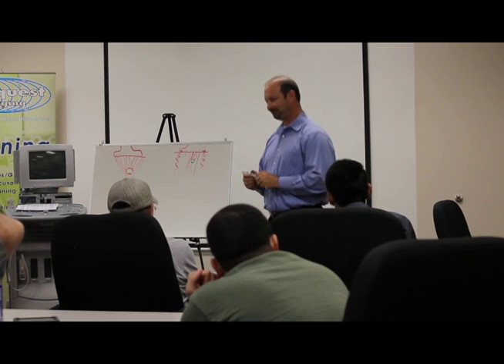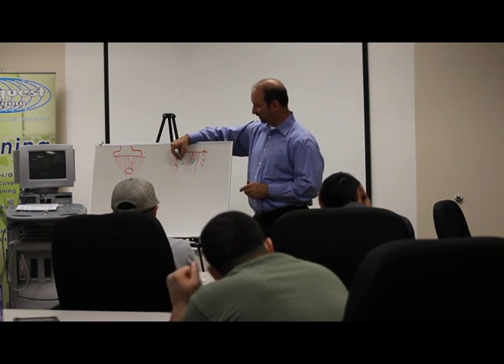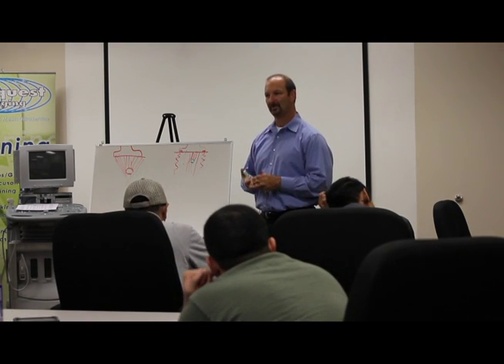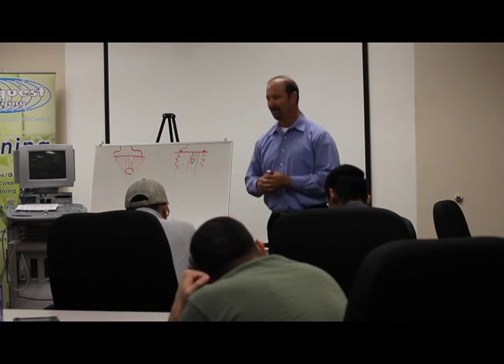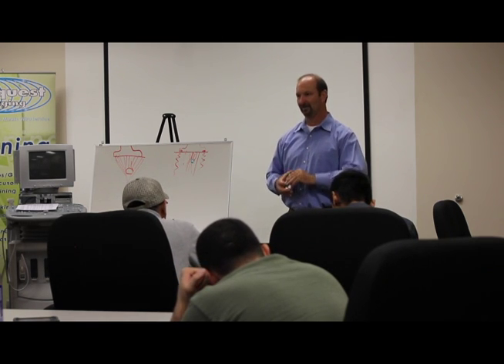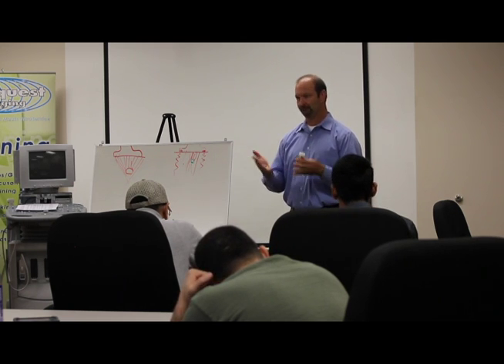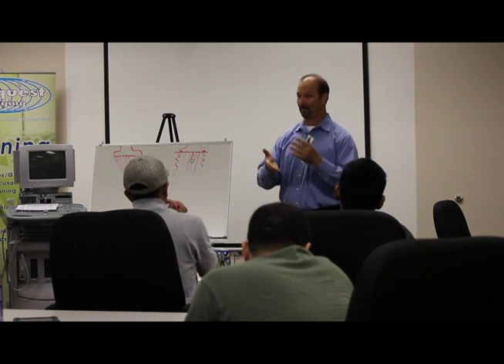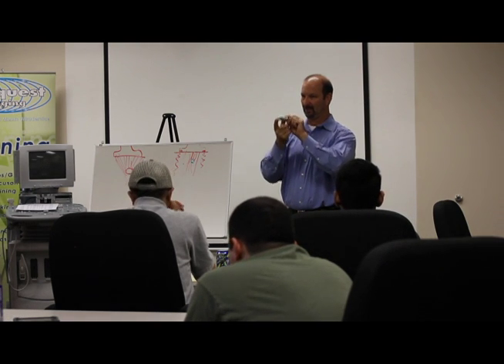Ultrasound, for the most part, is good to find things to about 2 millimeters. That's what they'll say. We know what a centimeter is, so 1/5 of a centimeter. That's pretty much what ultrasound sets as standard. You should be able to find everything up to that. Your phantoms, I think they'll go down a little smaller than that. That's fine. You can see smaller detail with compounding. Start hitting that one point from different directions, all of a sudden that little thing comes out.